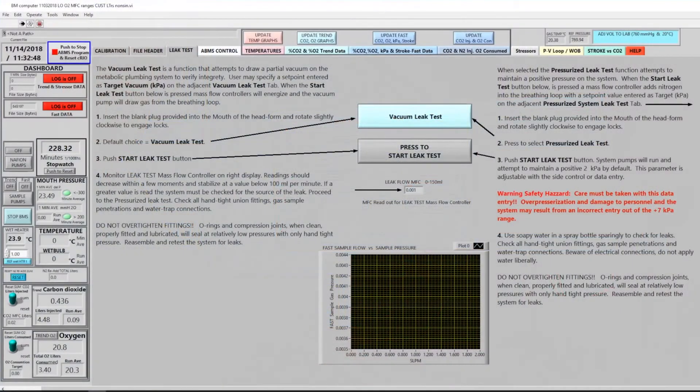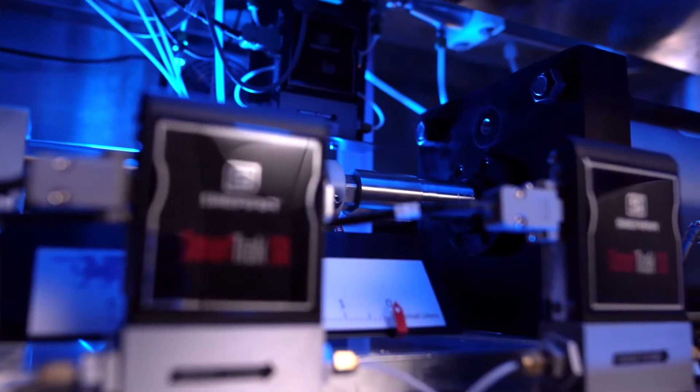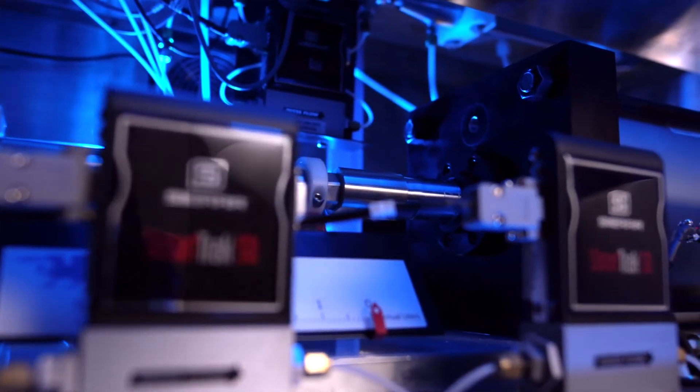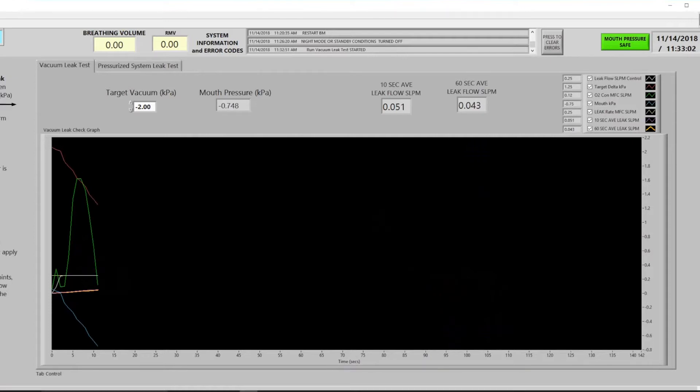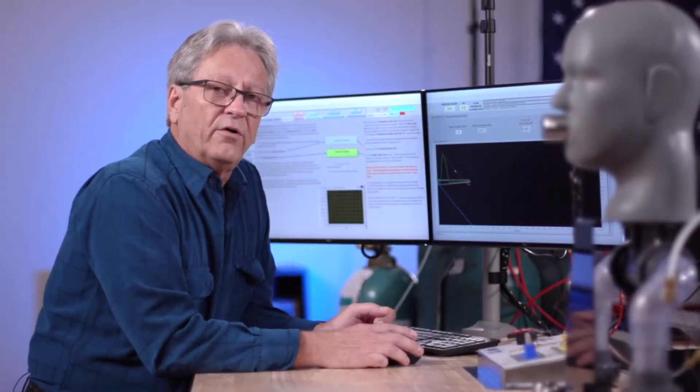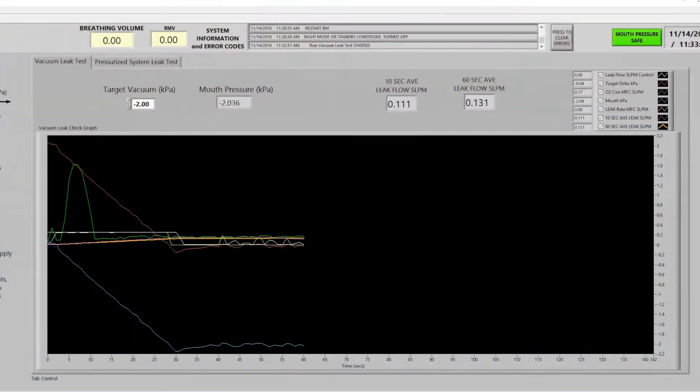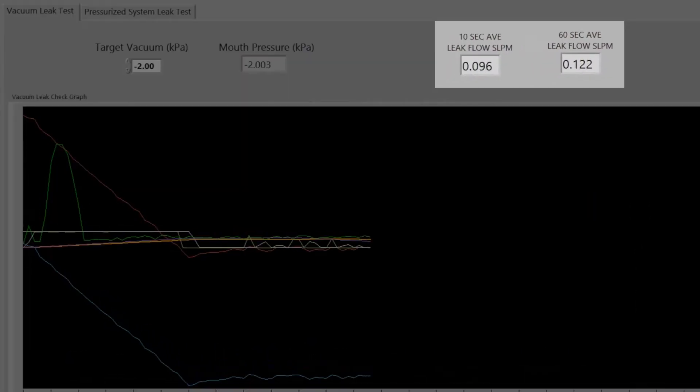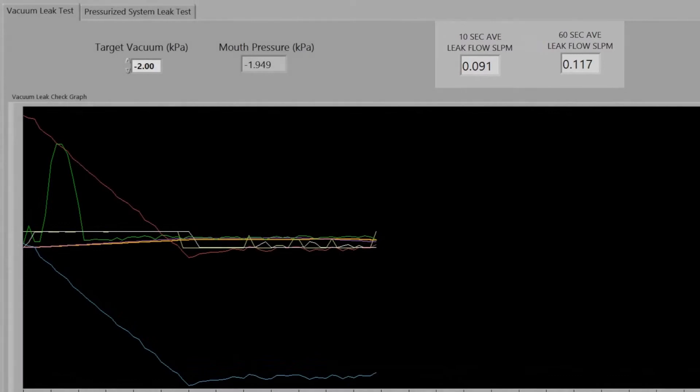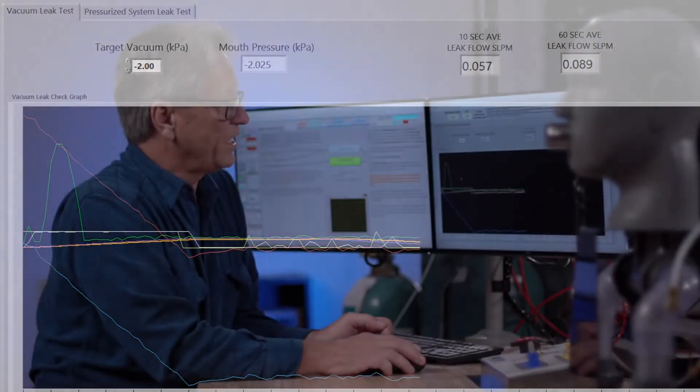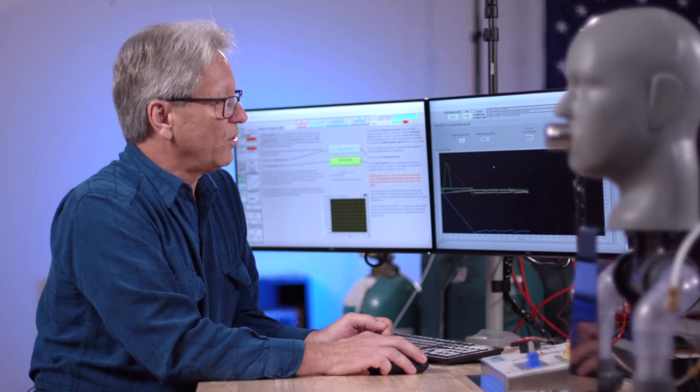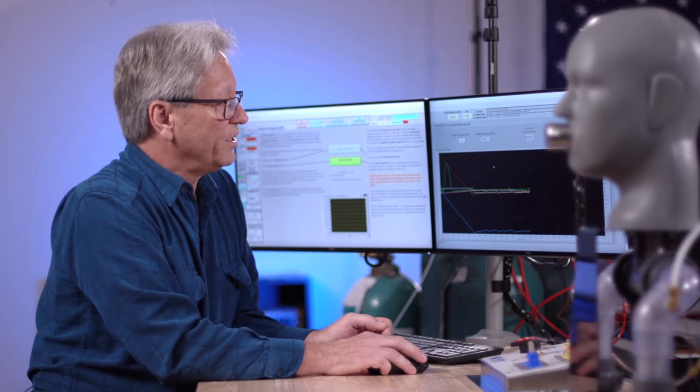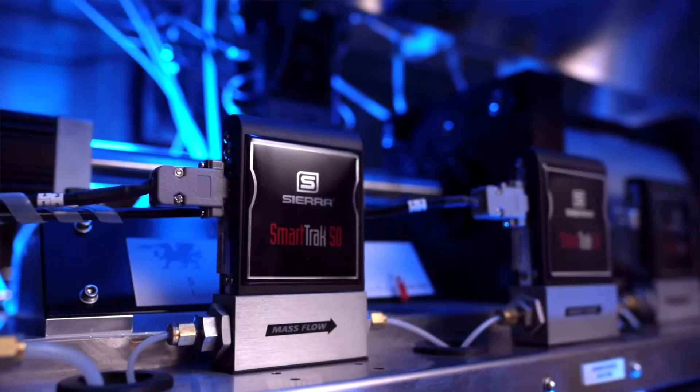Here on the left screen, I'll push the start leak test button and the vacuum pumps begin to pull down the gas process within the volume of the breathing circuit. We've set a target value of minus 2 kPa and you can see on the right screen here, the pressure is dropping rapidly. Any leakage rate under 100 milliliters per minute will conform to the ISO standard. On the screen, there are a 10 second average and 60 second average block. When those two units come to the same amount, we'll know that the system is in fact at its minimum pressure.